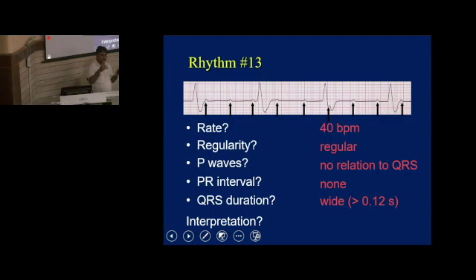Okay? The QRS complex, the Q wave, the R wave, the S wave, they show normal patterns only when the impulse travels through the normal path, from the SA node to the AV node, then to the bundle branches. Here, maybe this impulse is generated in the ventricular walls, at the apex, or wherever. So the impulse is coming in the reverse direction, maybe we can say that. So we don't expect a normal QRS complex. Is that clear? A normal, typical QRS complex will be seen only when the impulse travels from the SA node to the AV node to the ventricles. That is why here the QRS complexes are wide and haphazard.